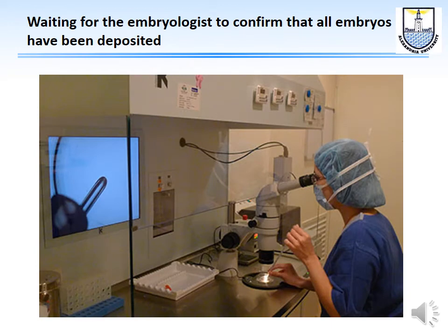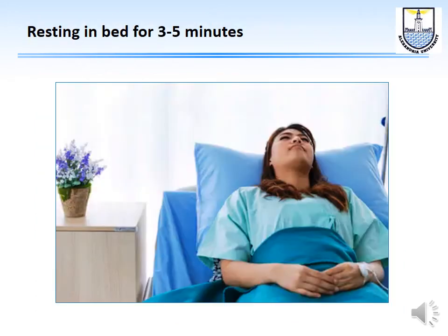And again, we give the catheter back to the embryologist, and she or he will look under the microscope to make sure that there are no embryos left in the catheter. If this is the case, we may decide to freeze them and put them in a subsequent cycle, or to put them back in the same run. Then we ask the patient to rest for 3 or 5 minutes, as I said, because longer than this is not necessary.